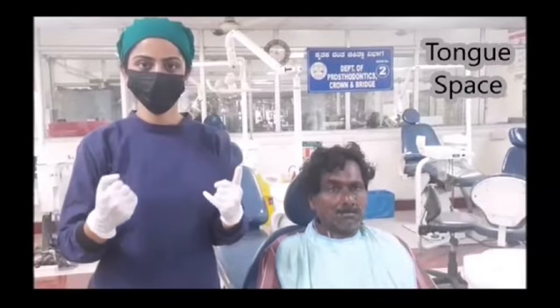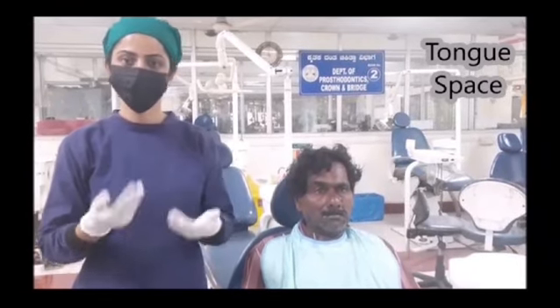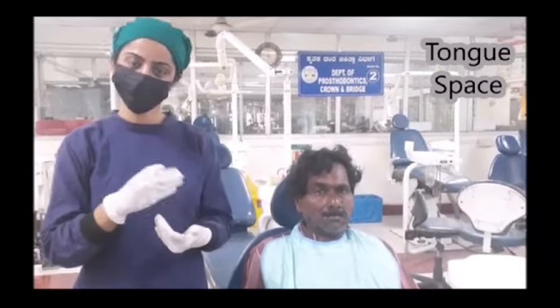Tongue space. The lower posterior teeth should be placed in the neutral zone between the cheeks and the tongue. Immediate movement of the denture indicates lack of tongue space. So it is differentiated from lingual overextension, where the movement occurs later. So it can be evaluated by asking the patient to raise the tongue.